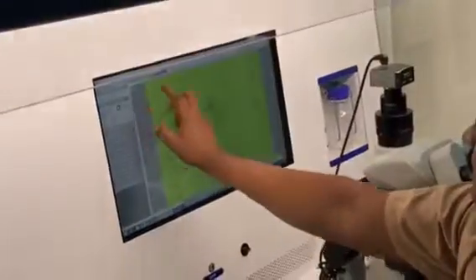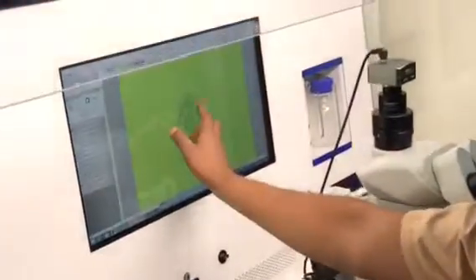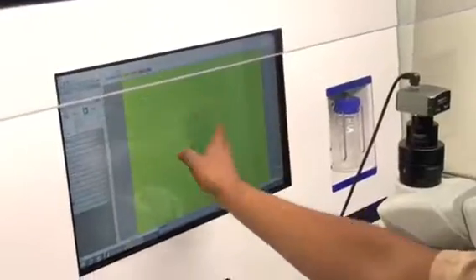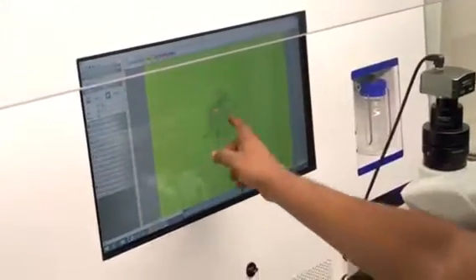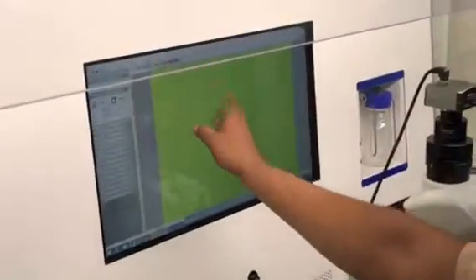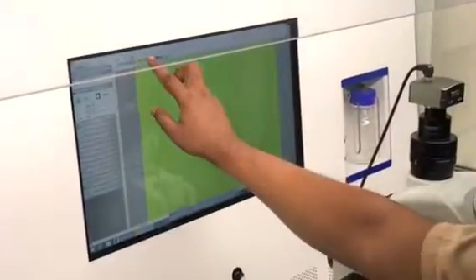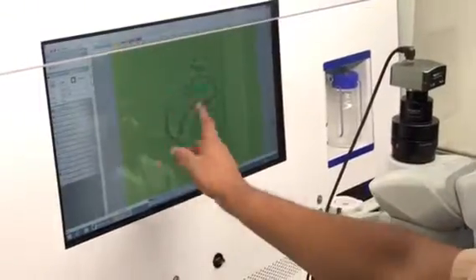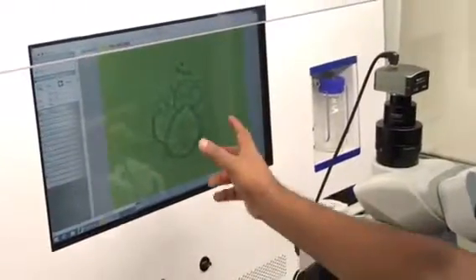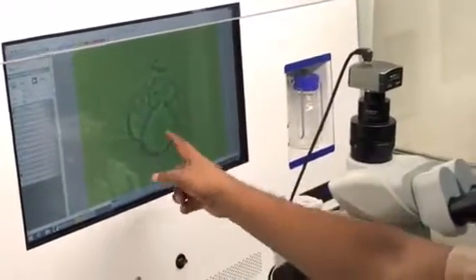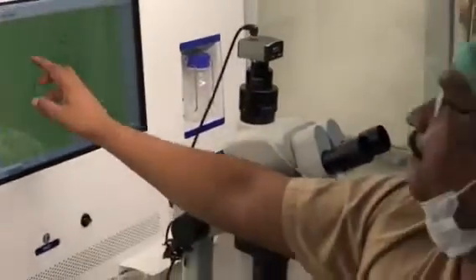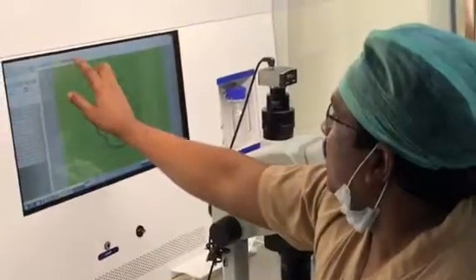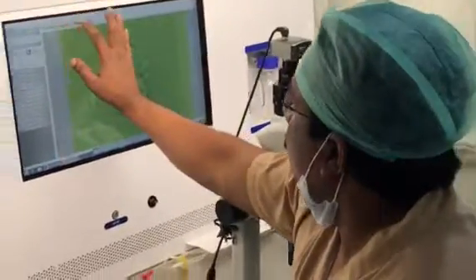We are taking this compacting embryo to blastocyst. This is an enlarged picture of the same, and we have an embryo transfer here.